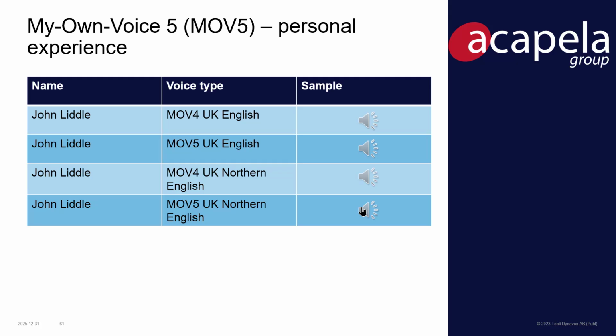Now, I definitely recognise myself in that voice and really happy with the quality of it. So I think the difference between 4 and 5 is fantastic.